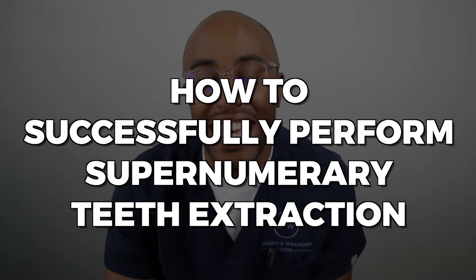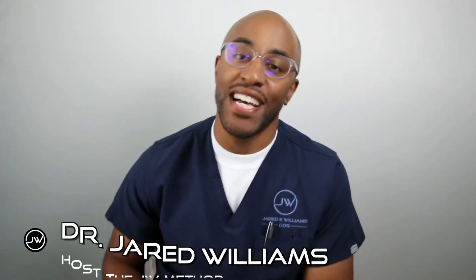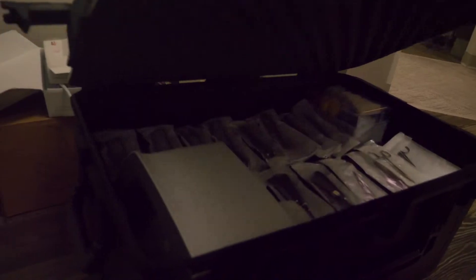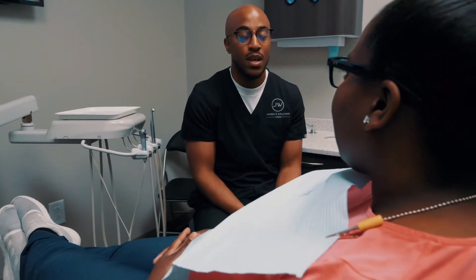It's a tip of the week. Today we're going to discuss how to successfully perform a supernumerary extraction. If you're new to the channel, I'm Dr. Jared Williams. I'm a concierge dental surgeon in Houston, Texas.